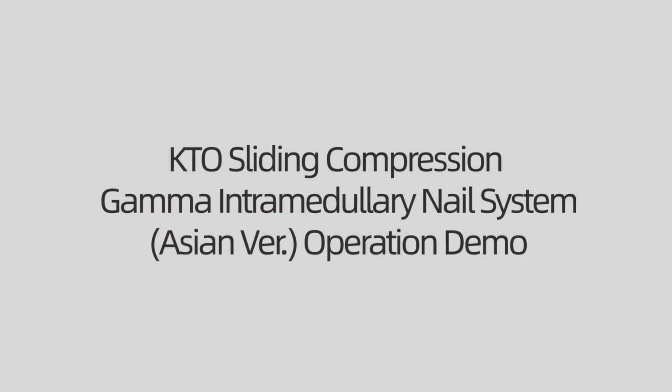KTO Sliding Compression Gamma Intramedullary Nail Operation Demo.